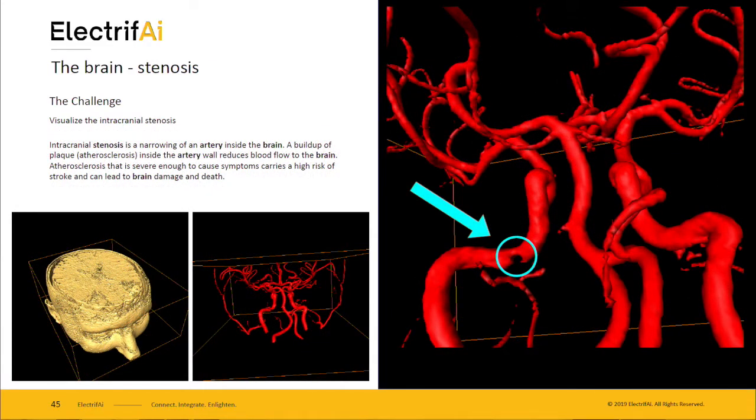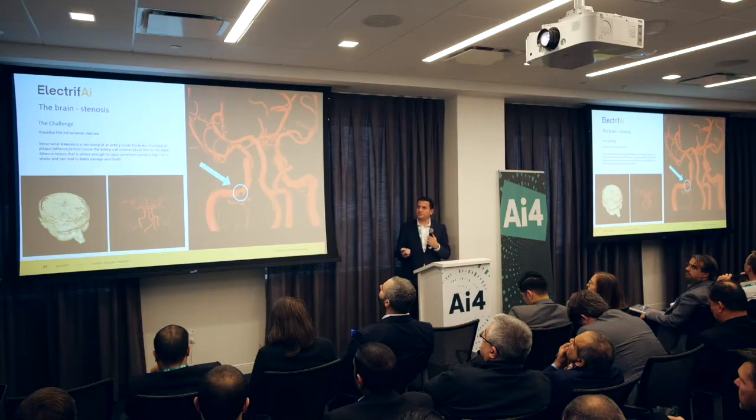Actually, this is a very interesting result because this was a piece of detail that was missed by an expert. We asked an expert to analyze this, and when you see this slice by slice, this is literally a 2 pixels wide gap. So what you see there is the growth of tissue inside the blood vessel that narrows down the passage, and thus you have less and less blood delivered to the brain. So this is just a little anomaly of 2 pixels wide, and when looking at those tiny little images in the 2D case, slice after slice, the expert missed that.